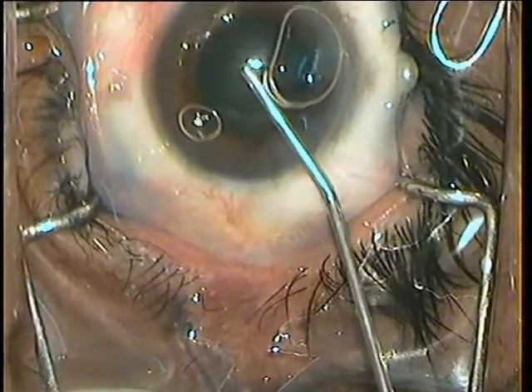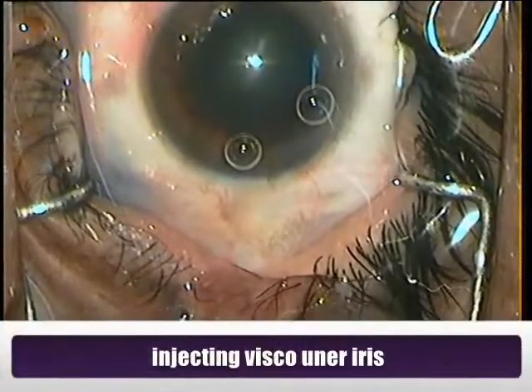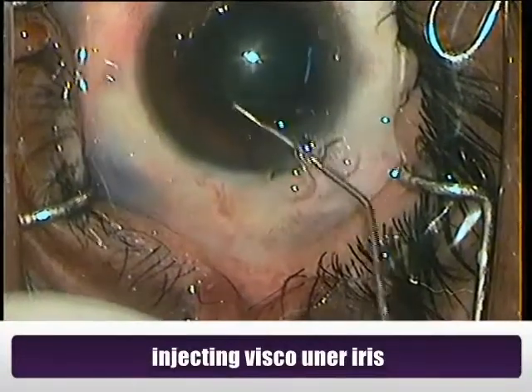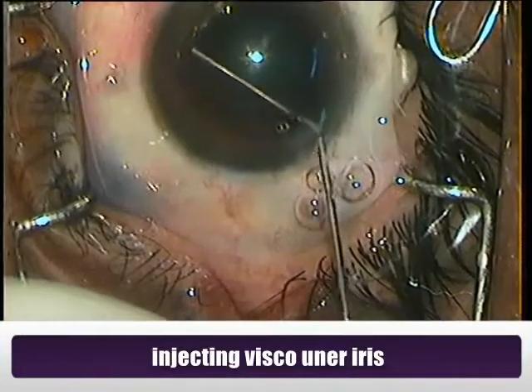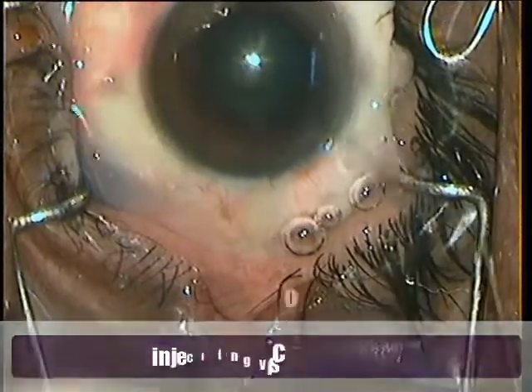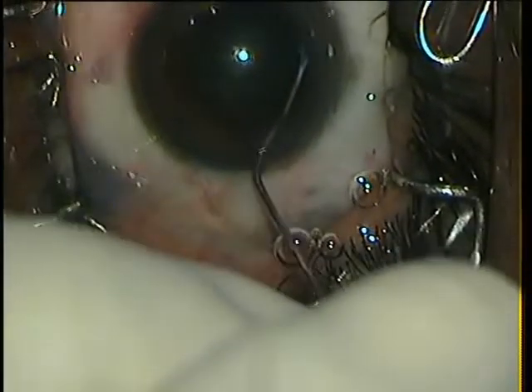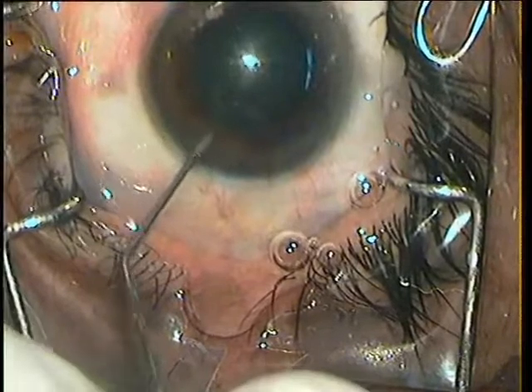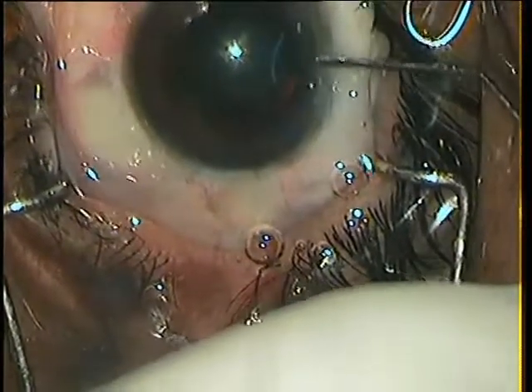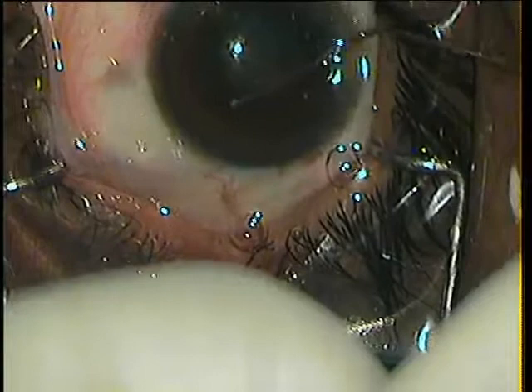Having stained the capsule, I inject visco. The pupil is not very small and I could have done it without the ring, but I want to take a try with the ring and at least it would prevent the pupil from further constricting. One of the most important prerequisites is to inject OVD under the iris all around. This will create some space for the ring to be placed under the iris. I am injecting it all around, even under the superior iris to the side port.